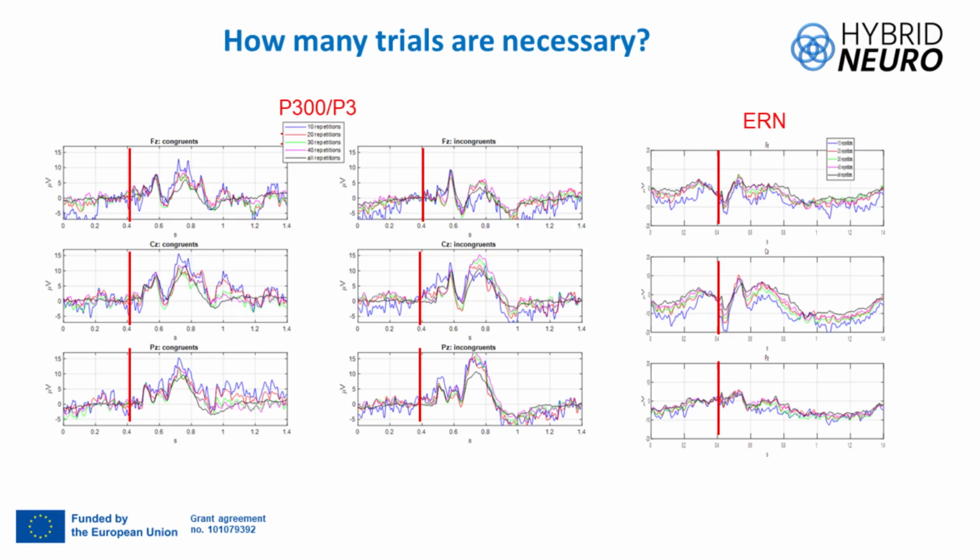It's not smoother. For example, if we calculate the maximum, the problem is, okay, the maximum is here, is here, is here. Probably it's better if you have just a few trials to smooth the potential later with a low-pass filter in order to calculate the peak, in order not to be so sensitive to these spurious peaks. High frequency is not always smooth because the number of repetitions is not so high. This problem disappears when you have more repetitions.